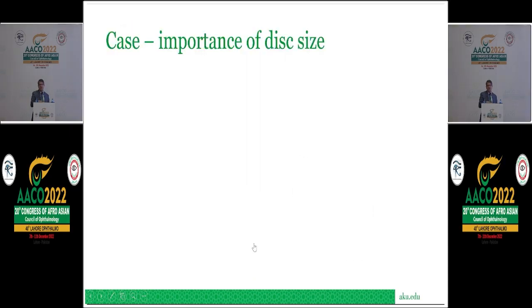The other thing that's important is the size. Now, different machines will give you size in different ways. So, in a very simple way, we can look at size by using a 60 diopter lens, for example, which should neutralize the eye, then measuring with the slit beam, or use the ophthalmoscope, etc., to estimate the width of the blood vessels relative to the disc.